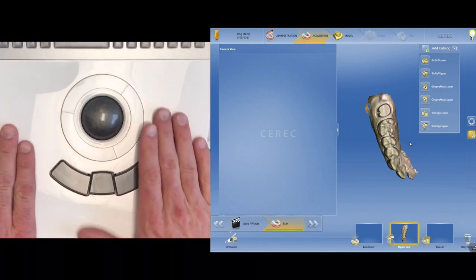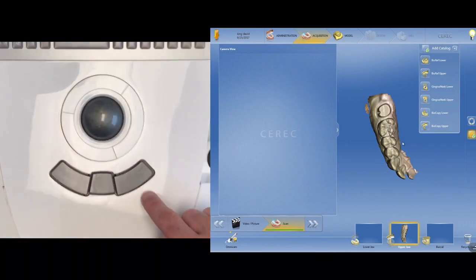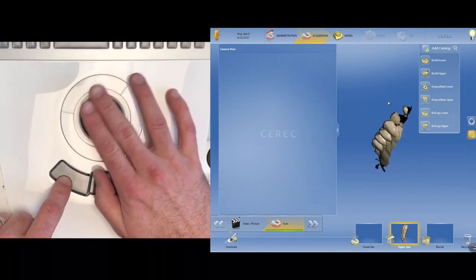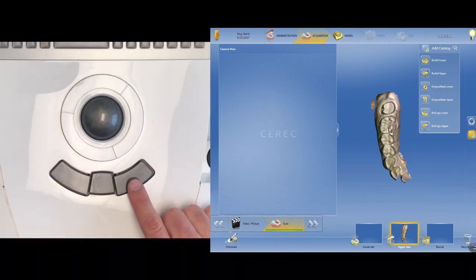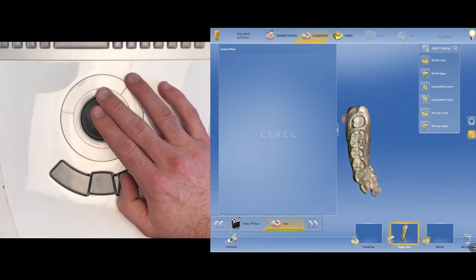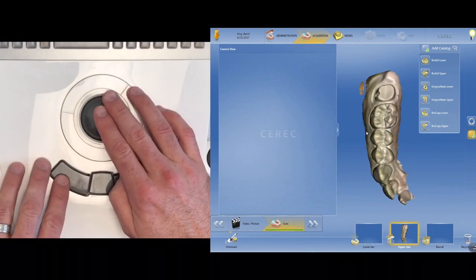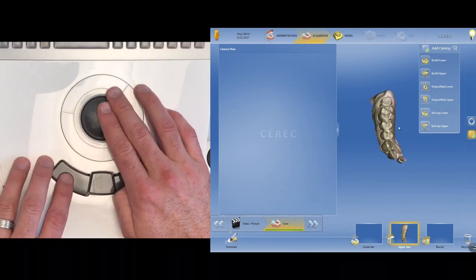In this screen, remember we have a rotate button and a pan button and a zoom. So this is rotate, pan, and zoom, right? If I'm going to rotate, I'm going to grab and rotate, and it basically rolls around as I'm holding onto that button. If I want to pan, I'm going to press and hold this, and you can see I use my thumb to pan it around. And then the zoom is in the middle. Press and hold again, I use my thumb, and I can zoom in and out to see how I like those images. So you can see how my hands are switching there. I really only use my index finger on my left hand.